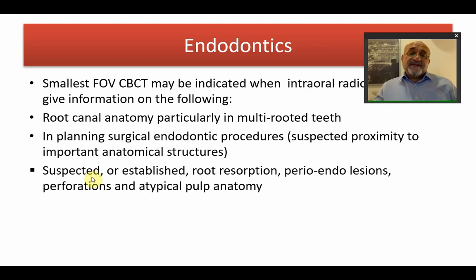If you suspect or there is an established root resorption, perioendo lesions, perforations, and atypical pulp anatomy, these are situations in which you may have a justification to expose your patient to CBCT, taking into consideration that you have failed to do this in the periapical radiograph and you have chosen the smallest field of view.